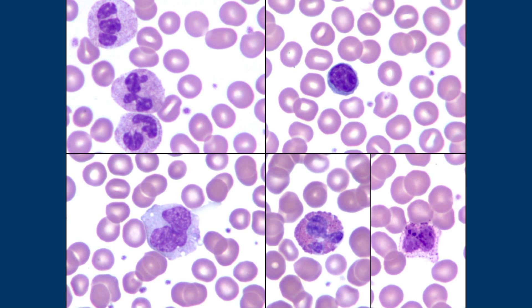Neutrophils generally have three to five segments. If more than 5% of your neutrophils have five or more segments, those are considered hypersegmented. Neutrophils with fewer than three segments are hyposegmented. Seeing five segments in just one cell isn't necessarily a problem — it only matters if it's more than 5% of the total. Keep in mind that cytospin slides can artificially give you increased segmentation, so that rule goes out the window on cytospins.